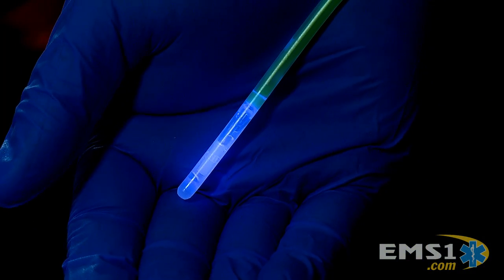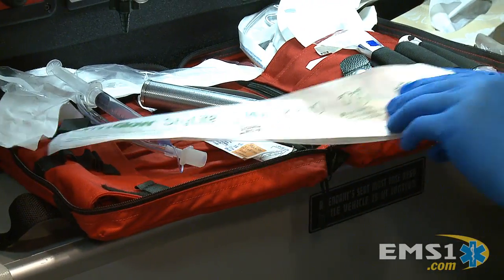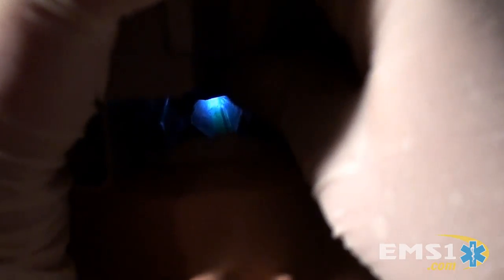This product is amazing. Omniglow says that this has an 18-month shelf life. So when it comes to stylettes, you have two choices: the old choice, which is okay, but really you should be using the Omniglow Stylite. It provides more light to the back of the oropharynx, it actually phosphoresces the cords, it's economical, and I really love this product. I'm Chris Montero and this is the Innovation Zone.